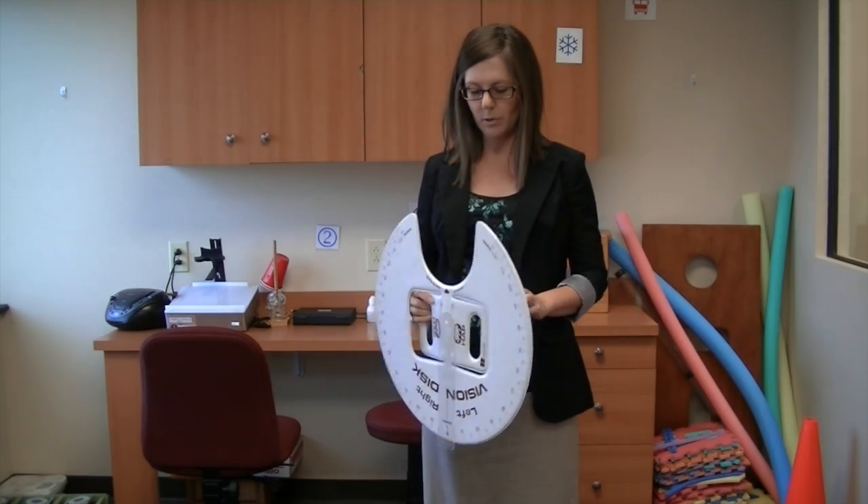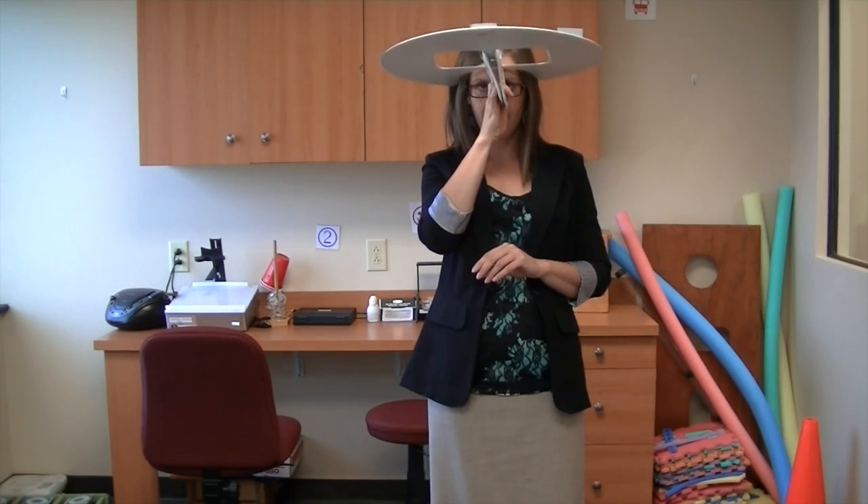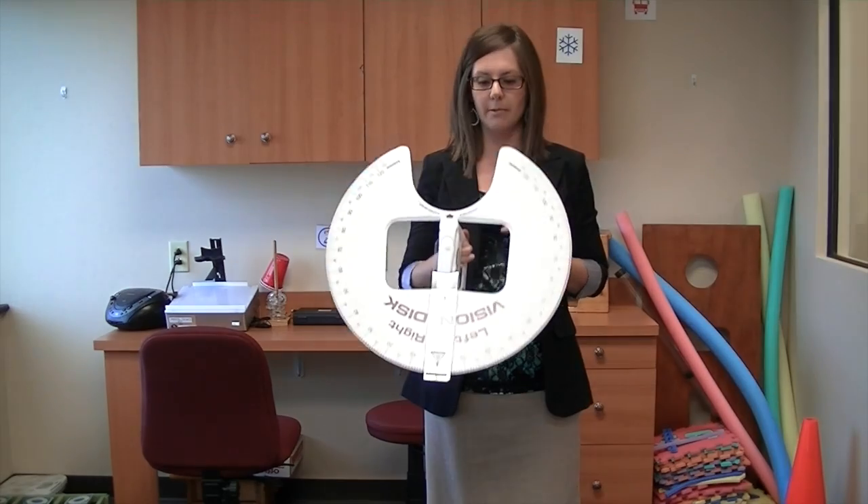What we actually do with it is we hold it in front of the patient's head just like this, and we have to line things up in the center of their forehead as well.